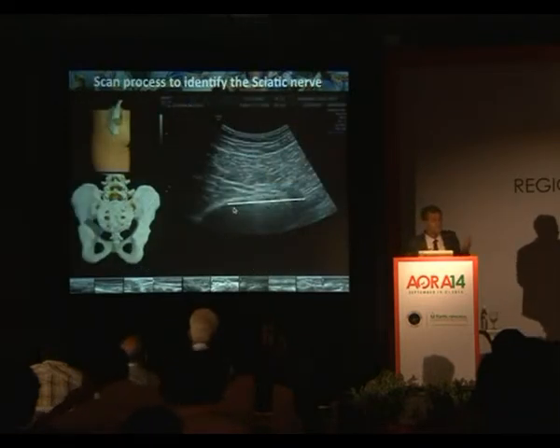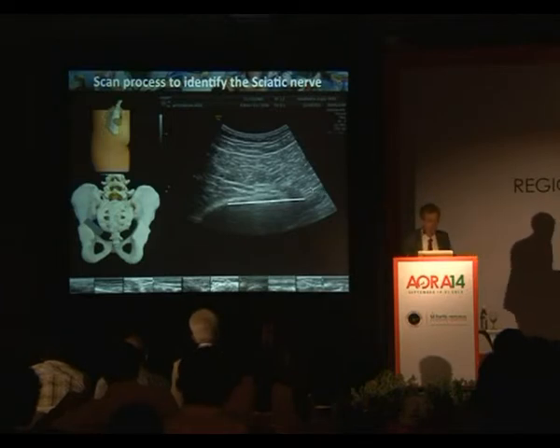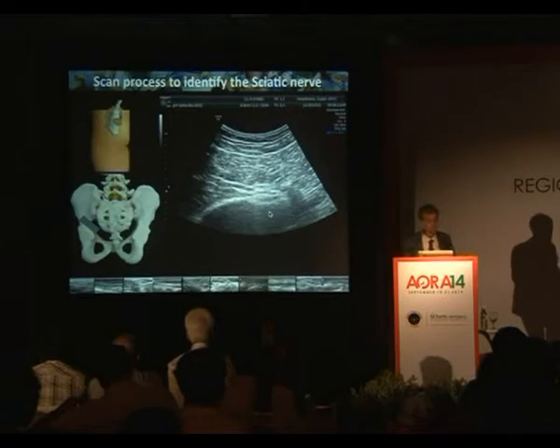I'm going to extend this line, this echogenic line. I'm going to make it as much as possible horizontal. But most of the time, it's like that. But I try to extend this line. And when I extend this line, I will be very happy because I will see that. If you look a little bit, you don't need to use the color Doppler. Here, you will see a pulse, which is the gluteal artery. And if you see the gluteal artery, you see the sciatic nerve, which is lateral.